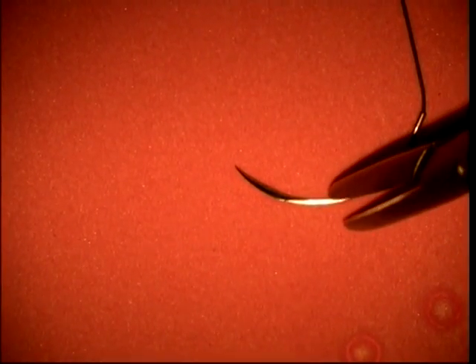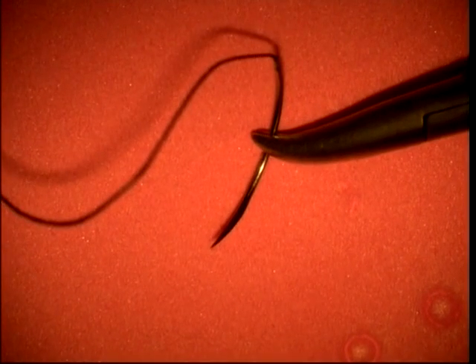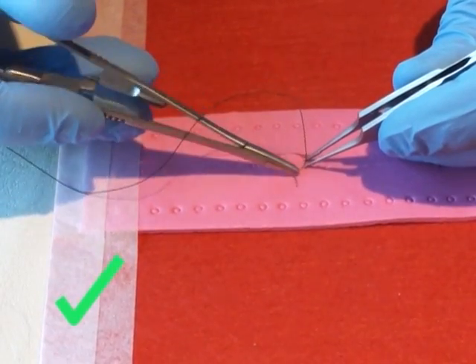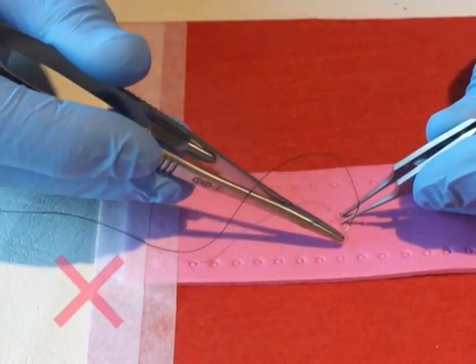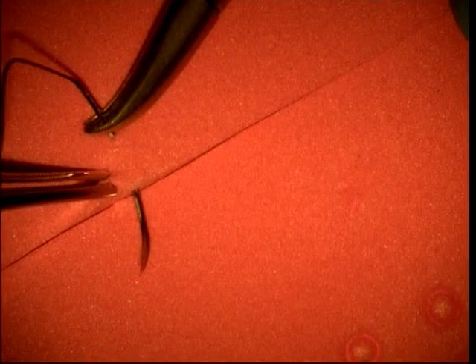Hold the needle at its midpoint in the tip of the needle holder. Don't touch the tip of the needle or you will blunt it very quickly. Pass the needle through the tissue, such as the skin, by rotating it, and not pushing it.